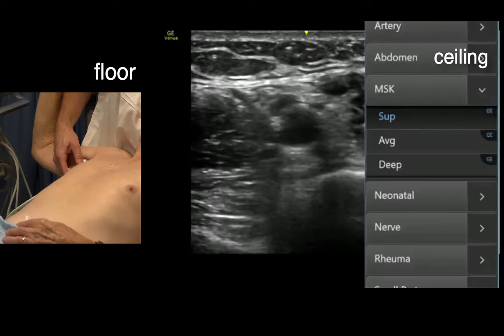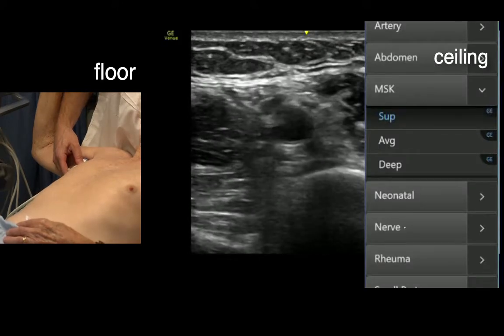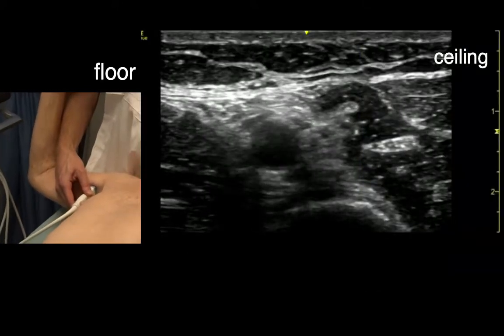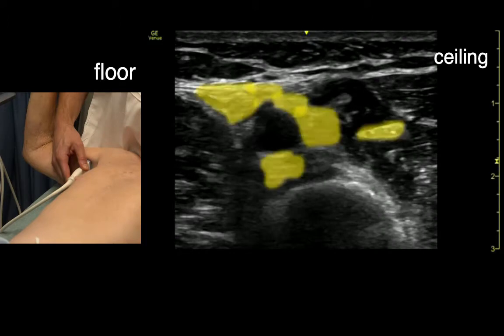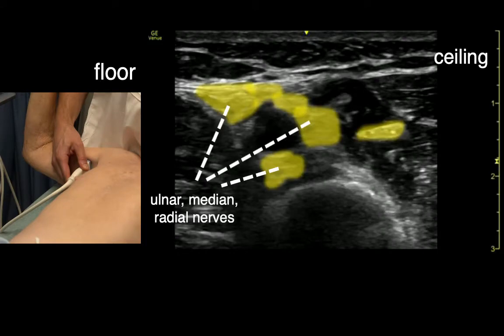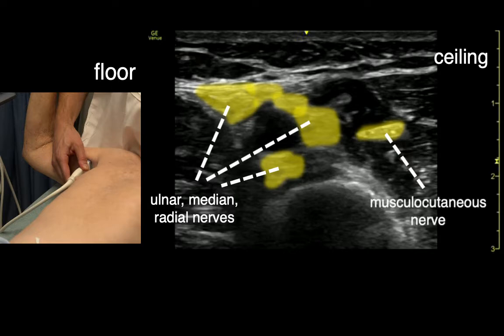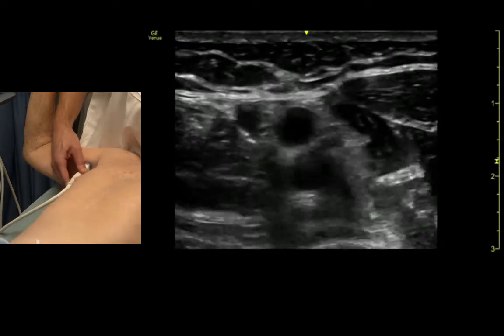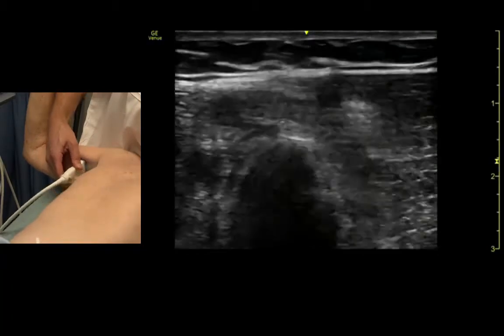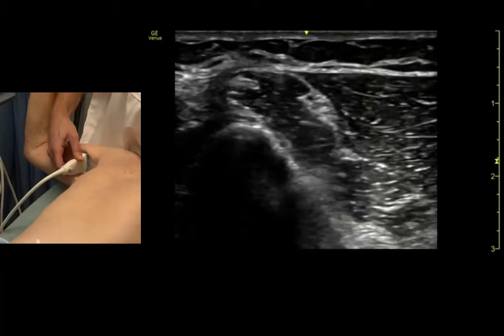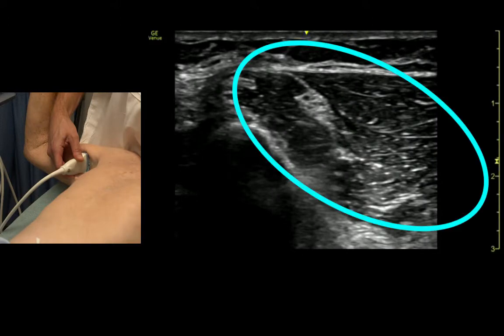The nerve tissue all wraps around. If you put it in a nerve setting, the nerve tissue becomes a little more visible. If we slide out into the biceps muscle a little bit, we can see the musculocutaneous nerve right there.